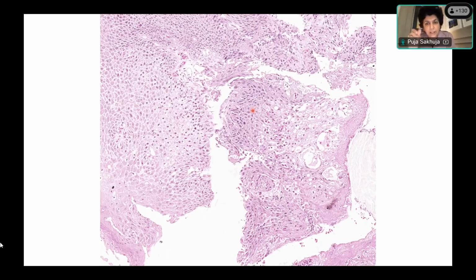Is anyone sure of the diagnosis? So, do you want to describe it? Yes, ma'am, I'll describe. Who is this? Anusha, ma'am. Okay, Anusha, come on, tell me your description.